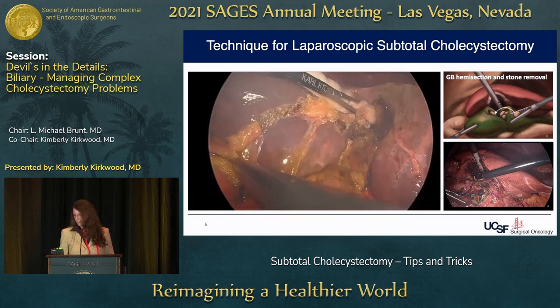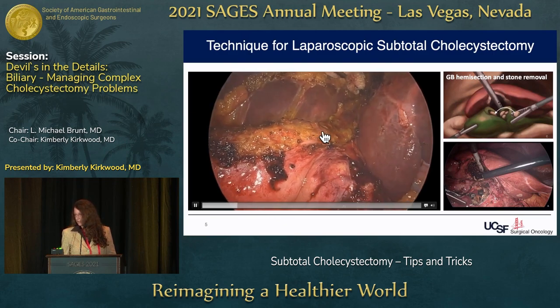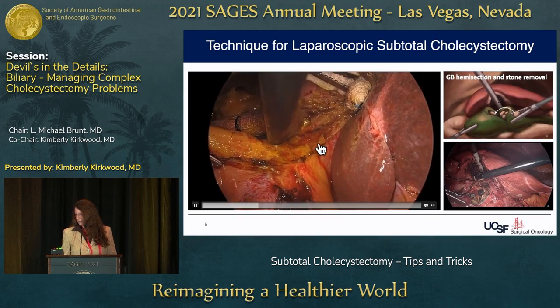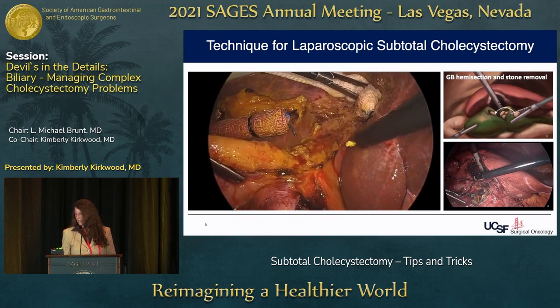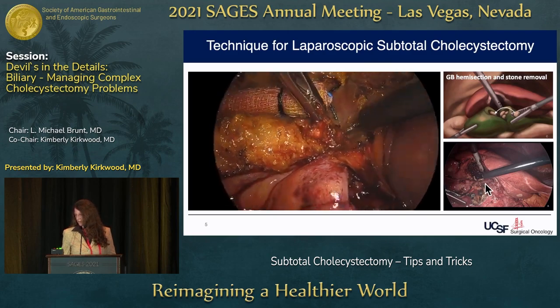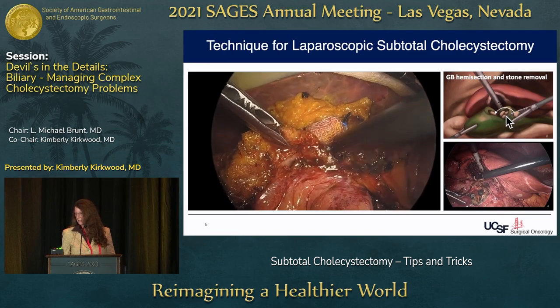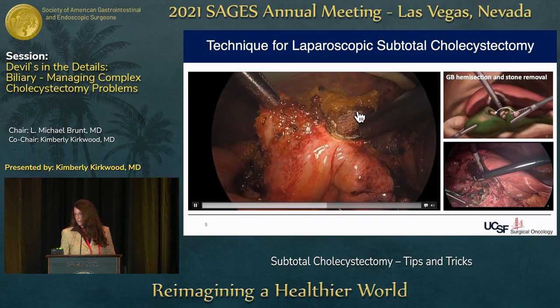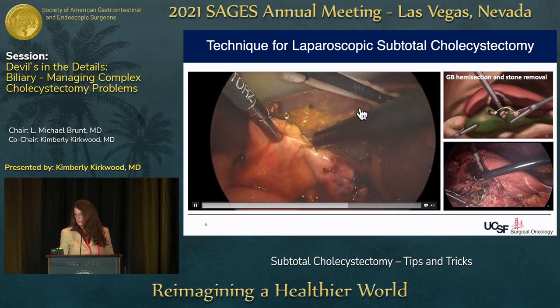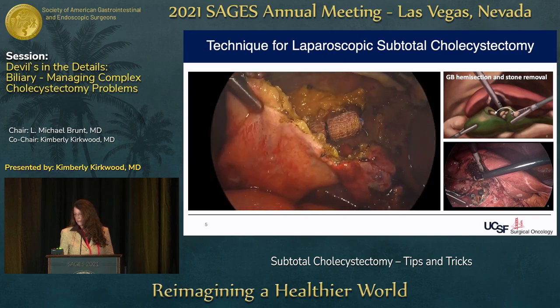By intentionally entering the gallbladder, you get some bile but much more information. You get a sense of the wall thickness, giving you better ability to stay right on the wall and do essentially a submucosal dissection. You work iteratively here. In a more typical case there are tons of faceted stones in the very thickened wall — you take those out and put them in the receptacle the fundus becomes in order to completely clear the infundibulum. We're hemisecting the gallbladder to provide a receptacle for stones and much better ability to dissect the infundibulum.